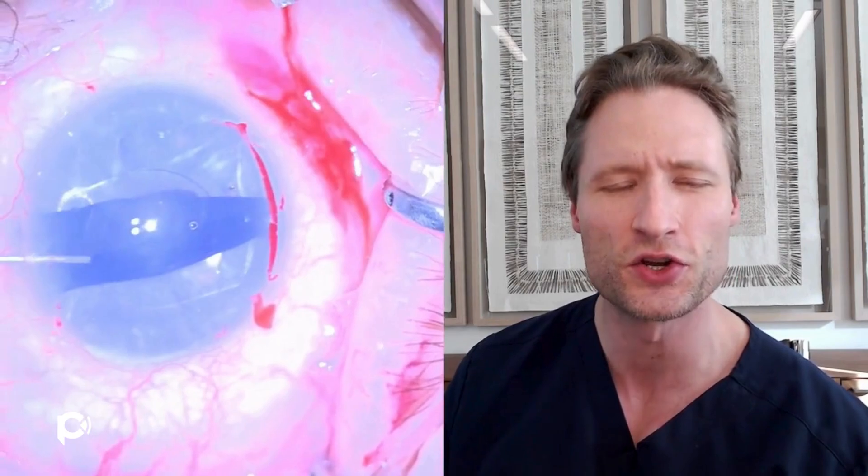I'm nudging the graft towards the center of the eye and using a cannula to try to access the edge of the tissue. Here's a trick that is very reliable and reproducible — that's why I want to show this video. I'm going to use a coaxial forcep in one hand to grab the edge of the graft and hold it to facilitate unfolding. I'm using a cannula to push the edge of the graft open, to prop it open so I can grab it with this coaxial gripping forcep. It takes a little maneuvering to pinch the edge of the graft, but we're not in any hurry.